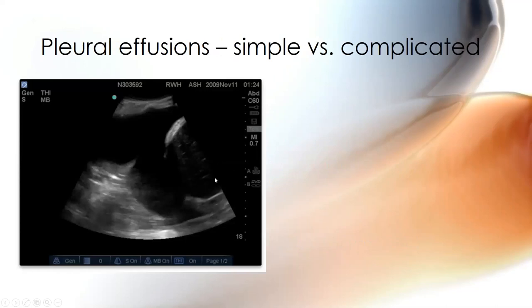So I don't have a ruler on this guy, but you would take the maximum diameter. This one's kind of fun. Was it here or was it here? You'd have to trace the diaphragm all the way around, but it's a rough guesstimate from here to here. And here's your scale again. These are each centimeter markings. If you just transposed, I'll do this from here to here. I mean, there might be 5 centimeters there. He might have a liter in the chest. A liter is a lot for the lung. If you've never watched a thoracentesis, people start to breathe a lot better after that first 200 that's out. So if it's 200 or more, I'll probably go after it.